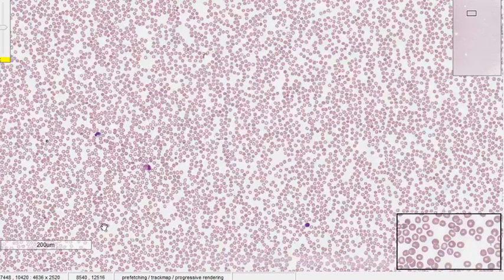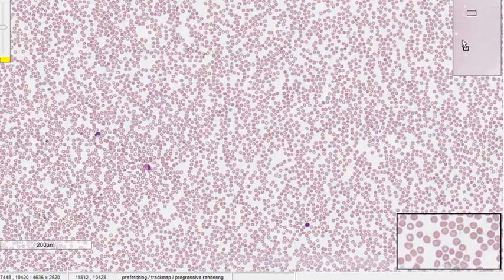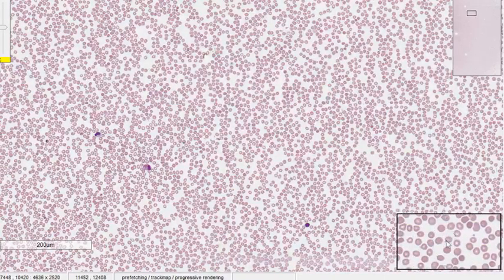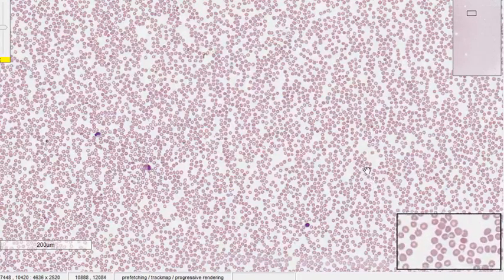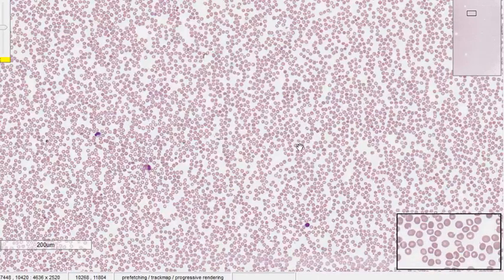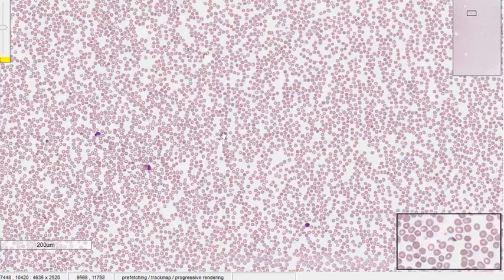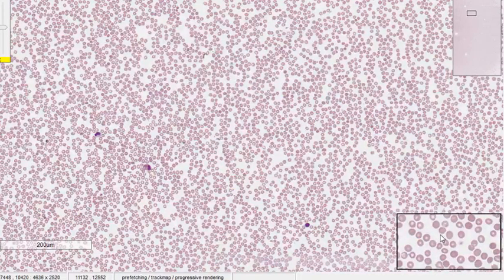Before that, if you look on the right hand side, this is the virtual slide that has been scanned, and this is the slide that we will be going into. And here in the right hand corner, you can see the magnified images. Wherever I am pointing, you can see that that area gets more magnified. The maximum magnification here is 400x, or 400 times. But here if you look, you can have a little bit more magnification. So let's go right into the case.